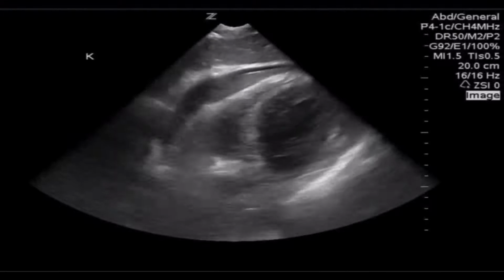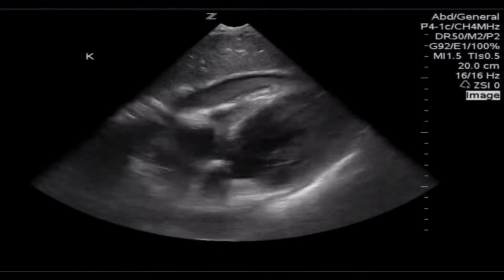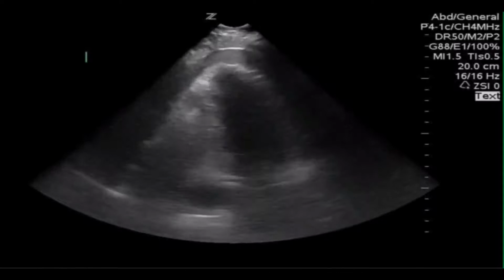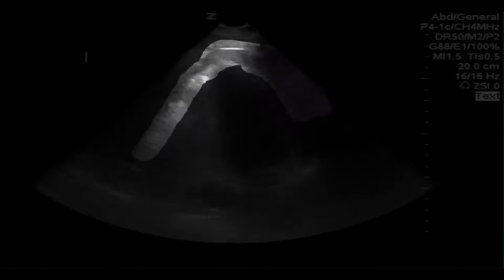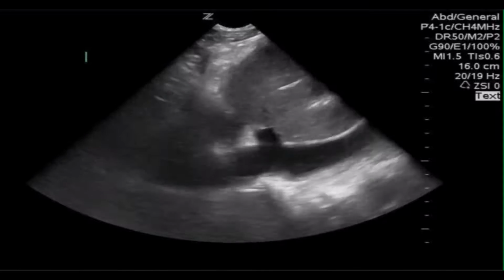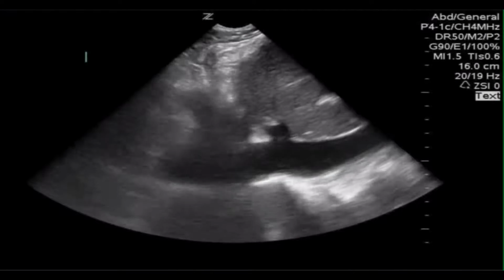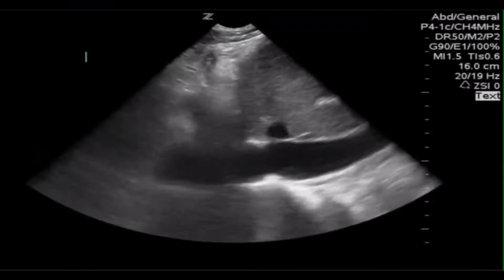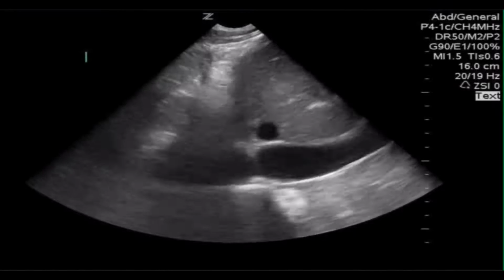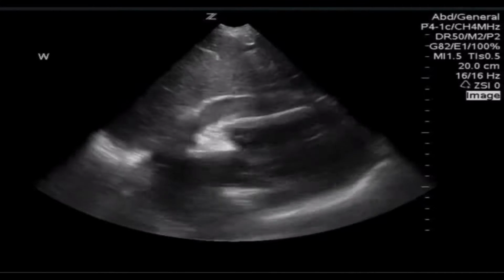So this is very concerning, either for another etiology besides aortic dissection or an aortic dissection that is now bleeding into the pericardium. This is confirmed again with an attempt at an apical four-chamber view. Here you see again a large pericardial effusion and likely coagulated blood as well. They go down to the IVC because they don't readily see signs of tamponade. In the long axis of the IVC, there is minimal movement and variation in the diameter with respiration. Therefore, I'm sure they were sweating, thinking about how this could be a rapidly accumulating pericardial effusion and impending tamponade.